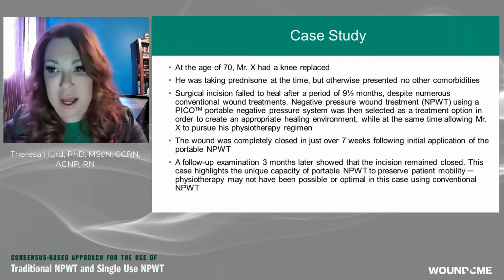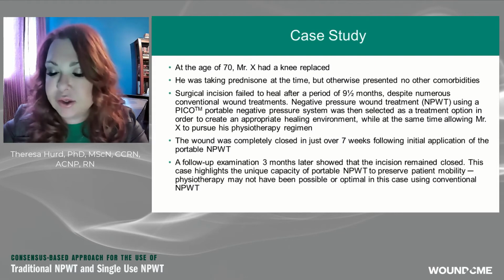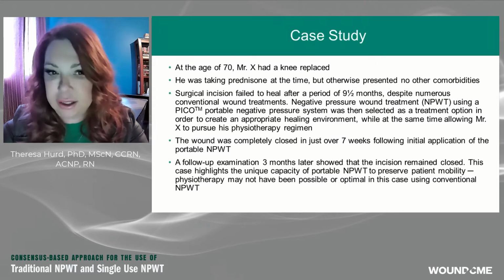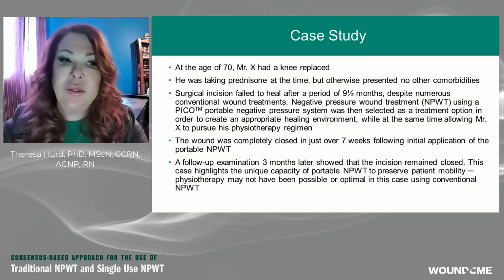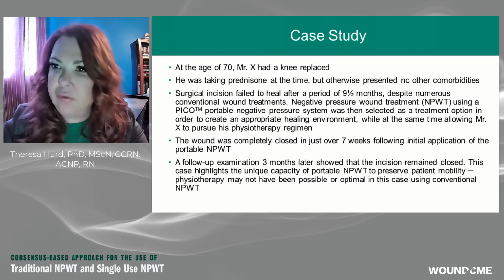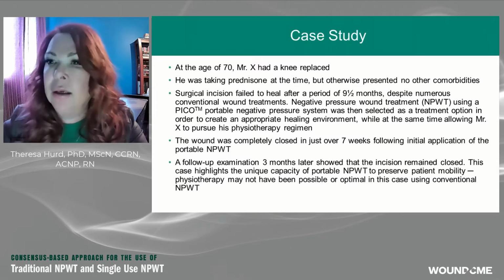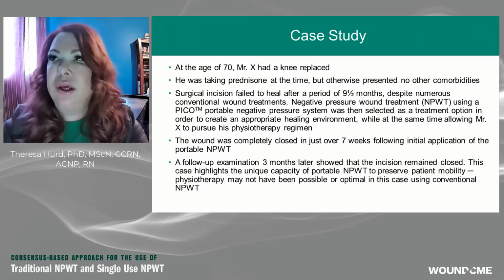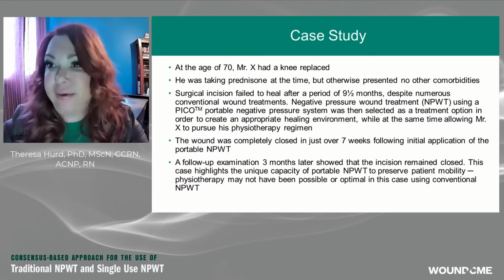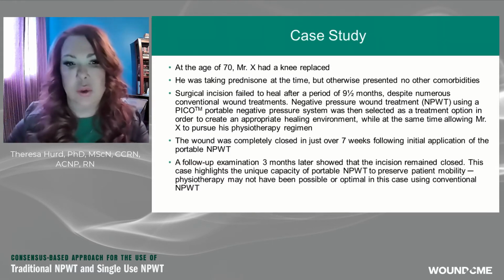So he had it 9.5 months ago, and it dehisced, and he had an open wound that went on for quite a bit of time. He'd been on some prednisone to manage his arthritis. And think about the cost of 9.5 months of having an open wound. Never mind the impact to the patient, the pain, the dressing changes, the barrier to life activities, the worry. Patients worry when they have wounds as well.